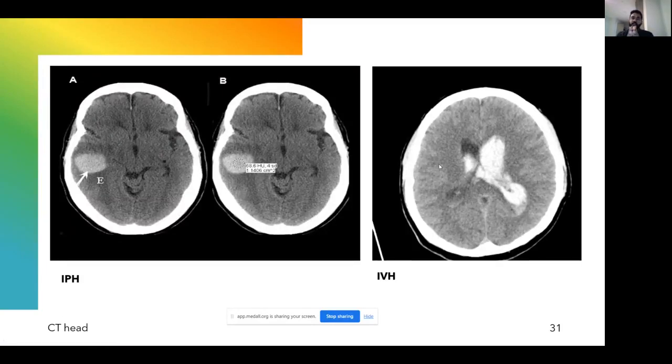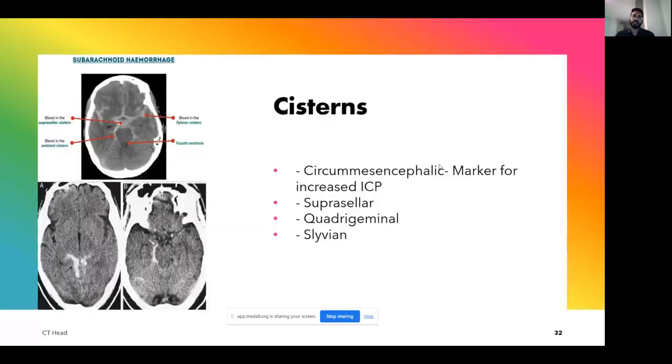So the first thing that you look for when you have a CT head is obviously the patient's name details, and then you look for if you can see any blood anywhere. If you are in a system, you can always go for the blood window, which will help you to figure it out faster. But if you are just having an image with you, like a printed image, always try and find out if there is blood in any of these locations that we have discussed.